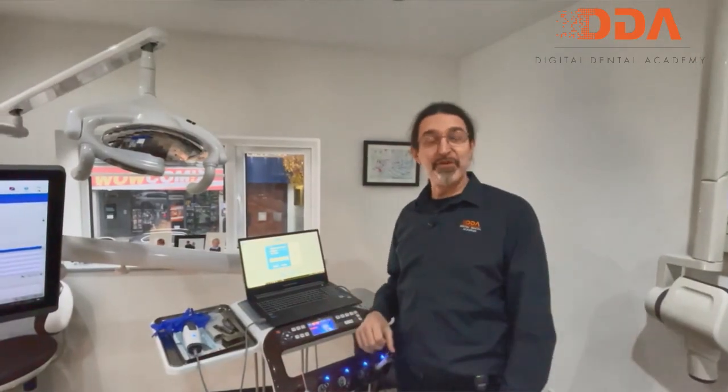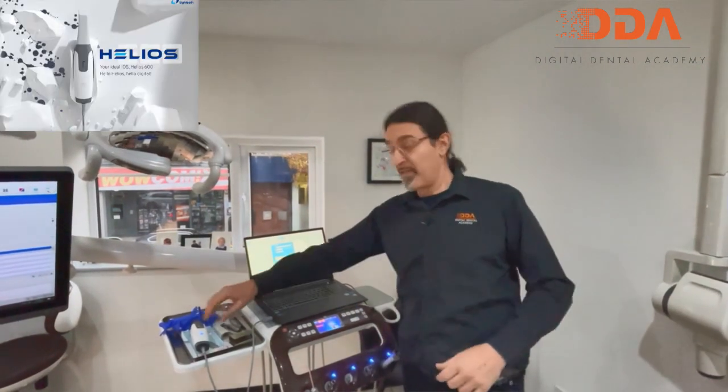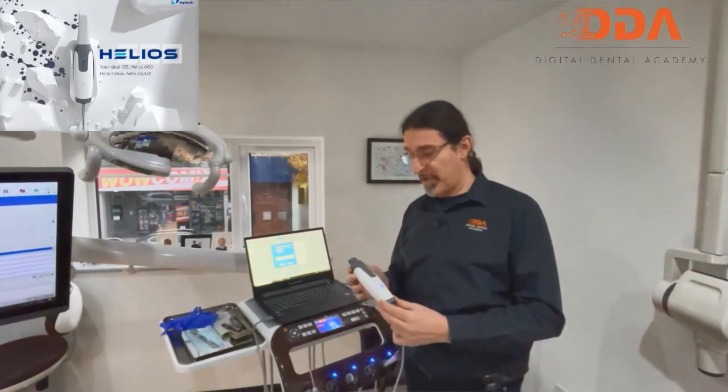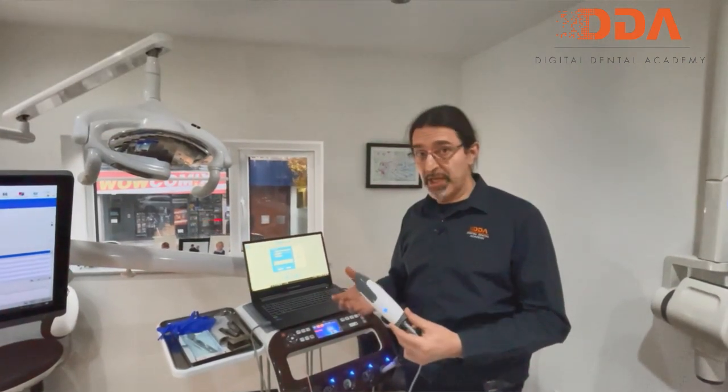Welcome to another IDDA review. Today we're going to review the Helios intraoral scanner by ATEETH. It's a really nice entry-level intraoral scanner with a small profile, very much the same technology as CareStream, Omnicam, and Planmeca.